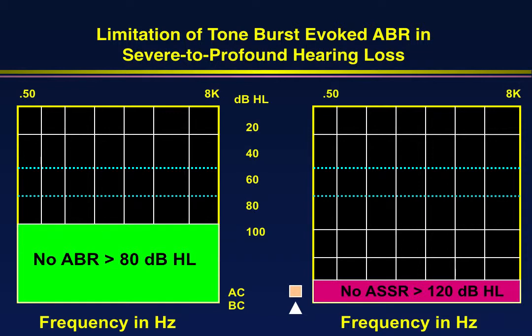Now, of course, we'll reevaluate them over the course of 3 months to 6 months to verify that there is no response to sound before making the final decision to go ahead with a cochlear implant.